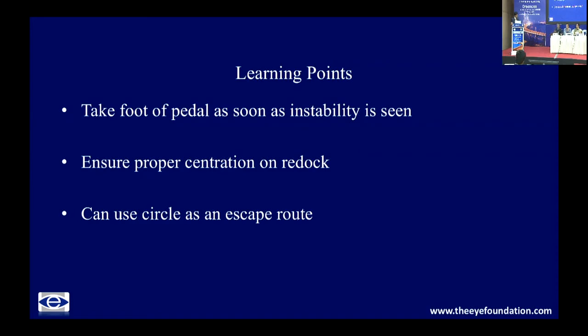So what I do is I take my old RK knife, preset it, and make an incision, and then go in and remove. I have videos. It works very well. I don't have to use another license, otherwise you lose a circle license, which is the same cost as a smile license. True, sir. Can you go on to your next?